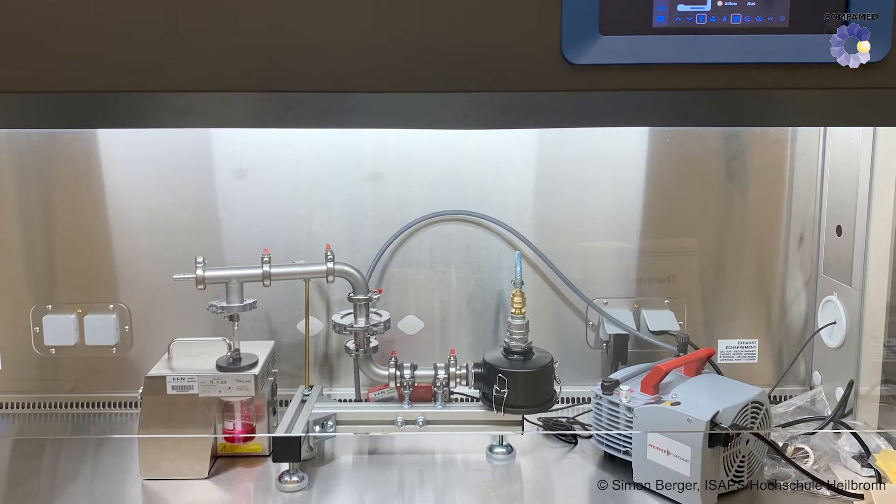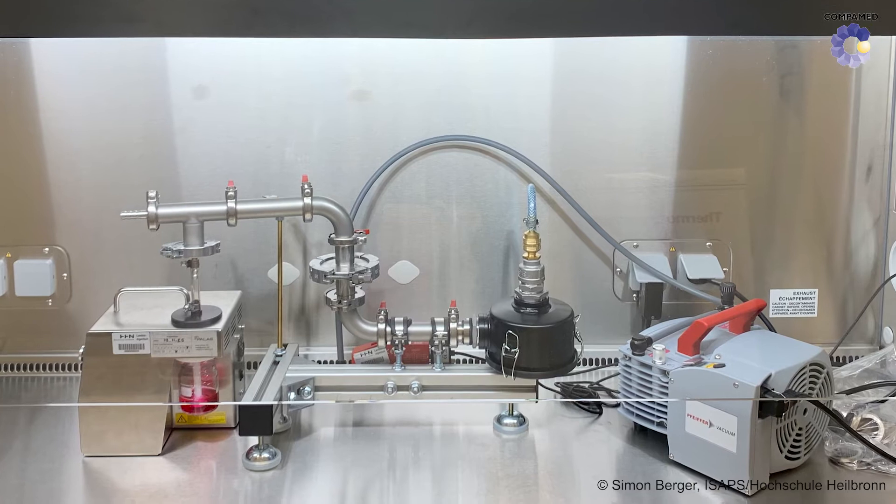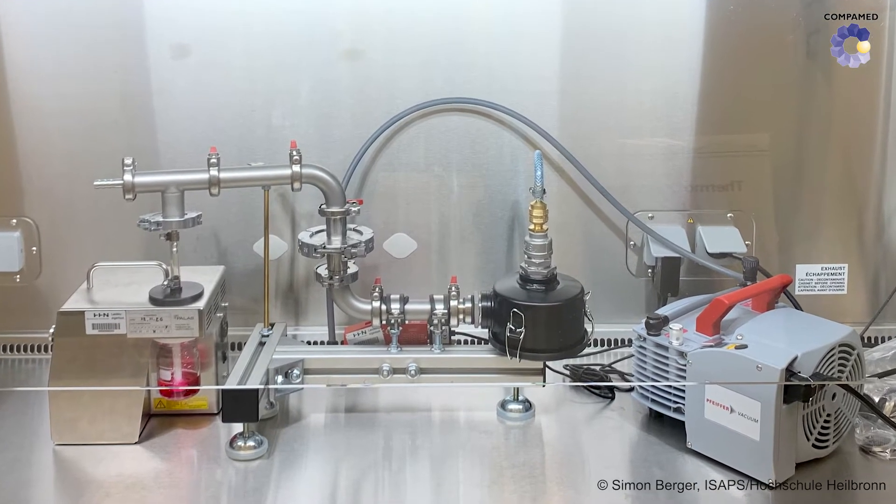And that's why the aerosol test rig will help us enormously. Because, for the first time, we can investigate the extent to which UVC is also suitable for inactivating the virus particle in aerosols, and, above all, what is needed to achieve this.